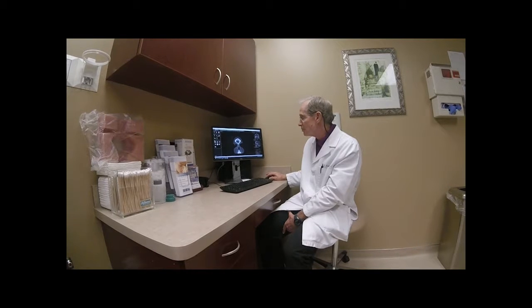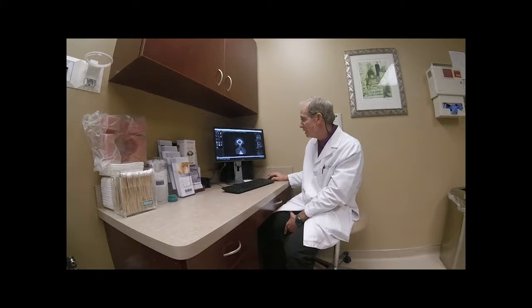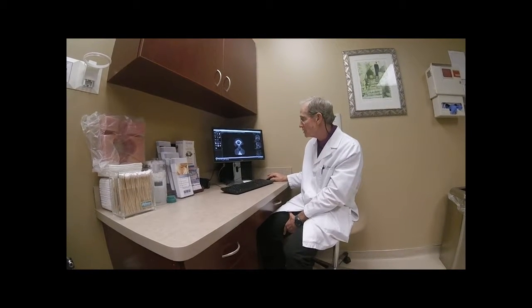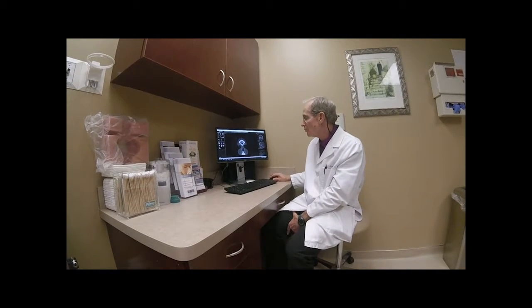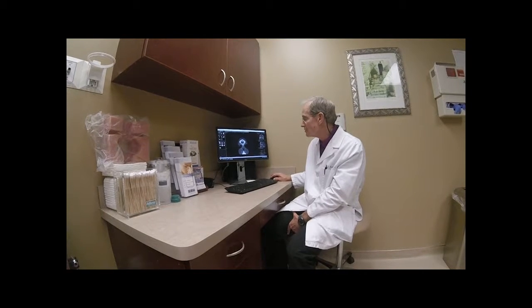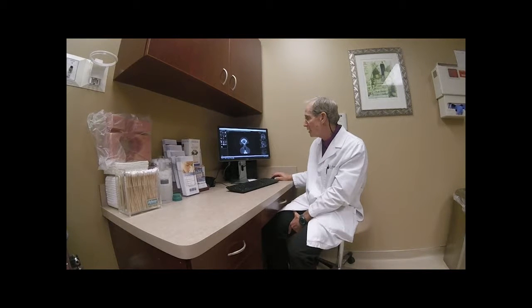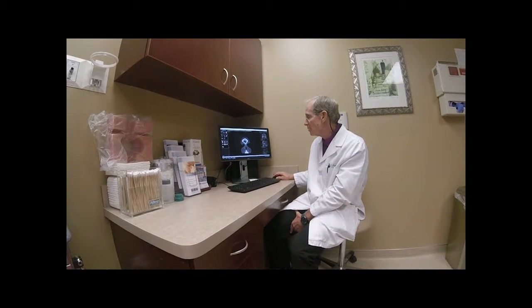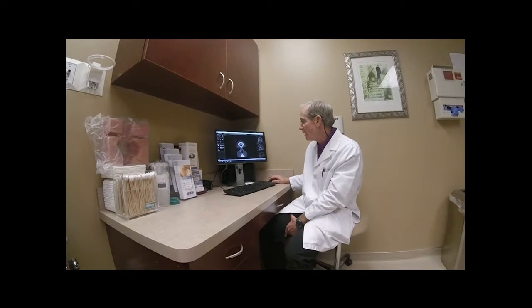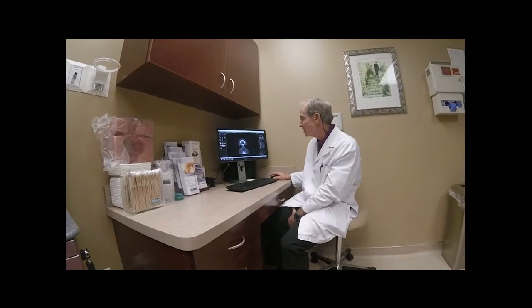Inside the nose there's a partition called the nasal septum, and when it's normal it is a midline structure dividing the inside of the nose into equal right and left cavities. The first set of sinuses we pick up are in the forehead — these are called frontal sinuses. There's usually a thin bone separating the right from the left, and often the frontal sinuses can be very asymmetric, which is not an abnormality; it's common for them to be different sizes and shapes.